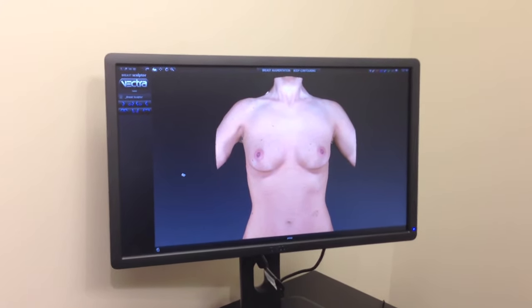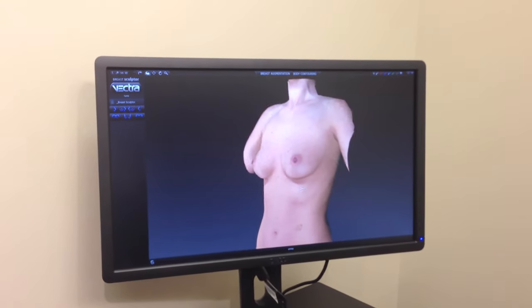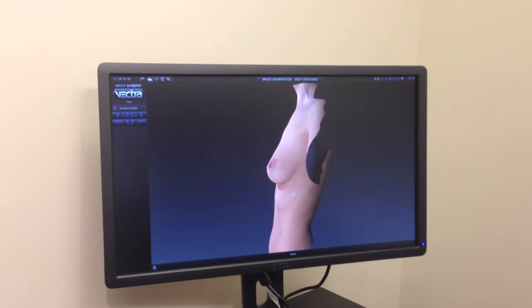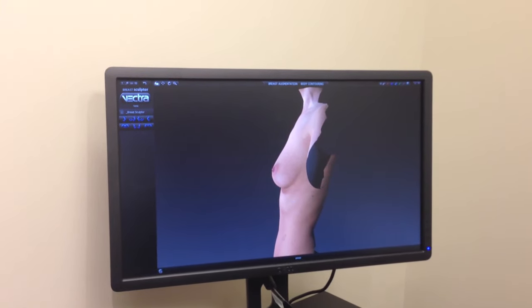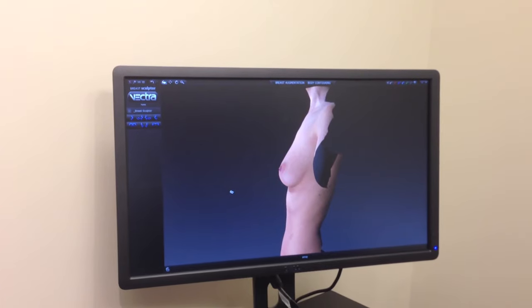And in this picture what you can see is the frontal view of the patient and we can actually show the patient moving over to the side and you can see the side profile of the patient and how she has a normal teardrop shaped breast.